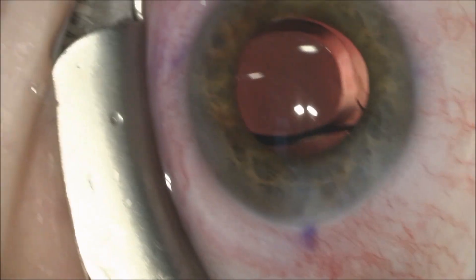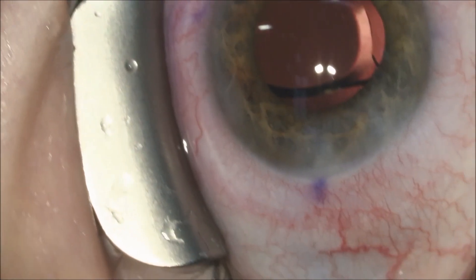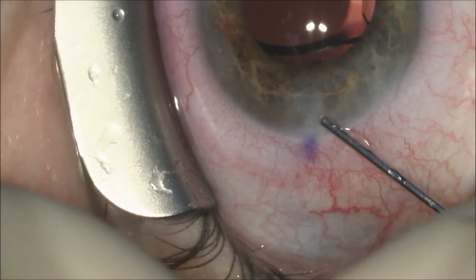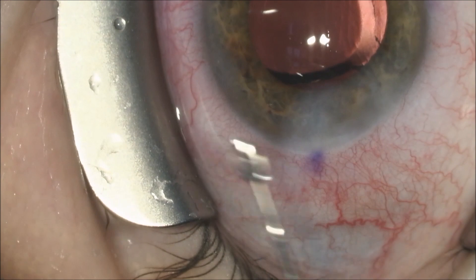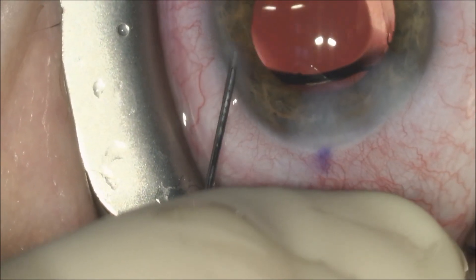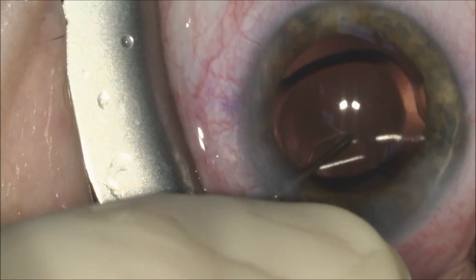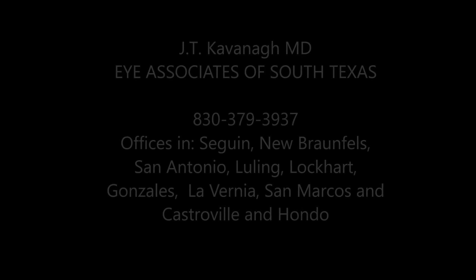There was some patient movement, and as we recover our position, we ascertain the lens position. We will again hydrate the clear cornea incision using balanced salt solution to make the wound leak-free. We'll inject fluid through the side port incision, center the intraocular lens, and this completes the case.